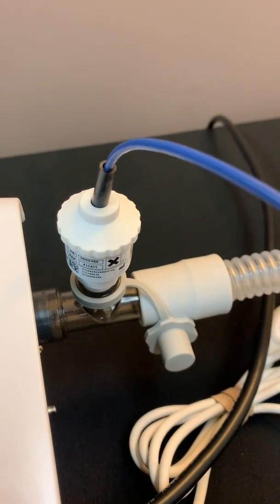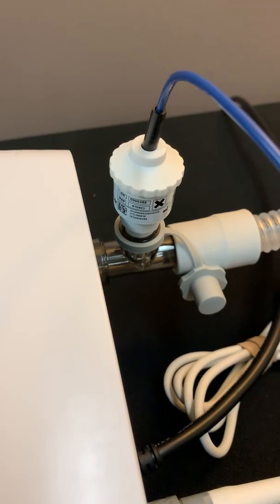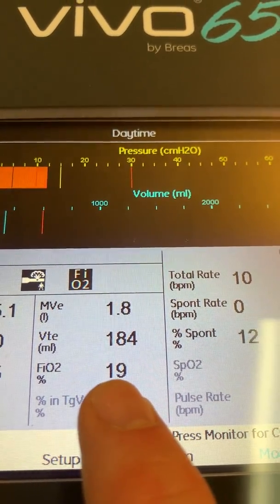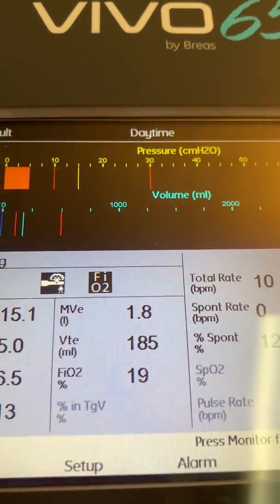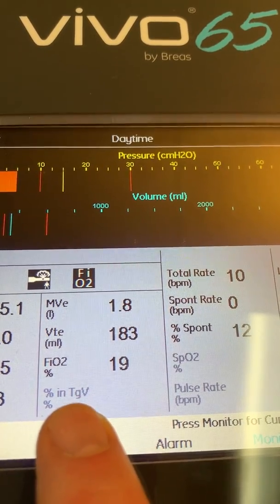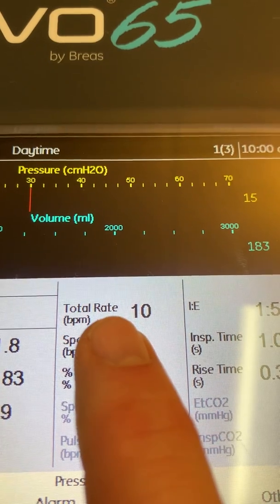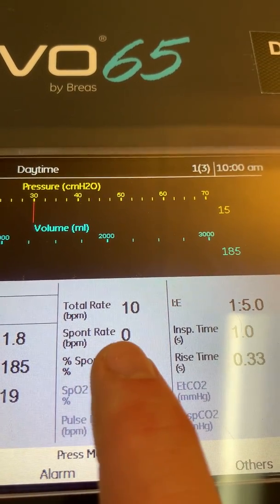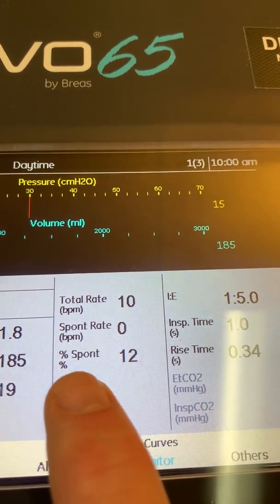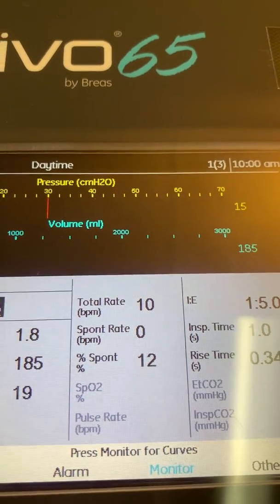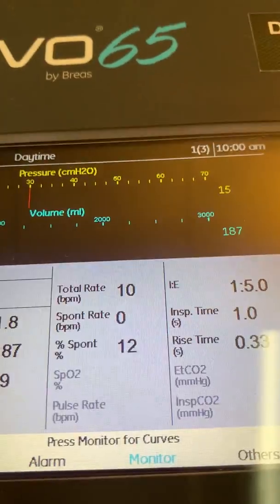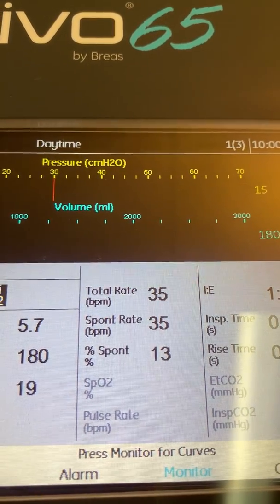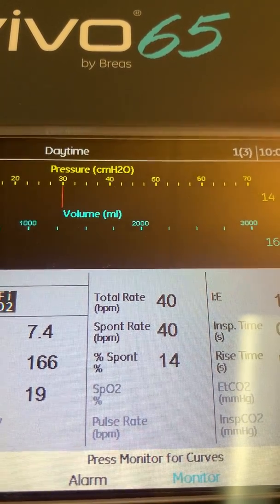The external O2 sensor is connected and the FiO2 is being displayed. Total rate, spontaneous rate, and spontaneous percentage are also shown. The total rate is currently 10 with no spontaneous rate. The spontaneous percentage reflects how often the ventilator recognizes a spontaneous breath — squeezing the test lung causes that percentage to increase as the patient initiates spontaneous effort.